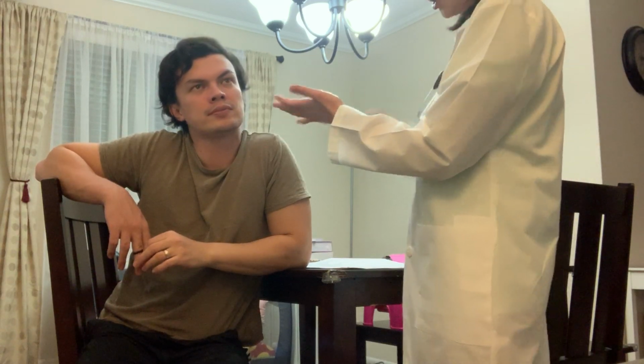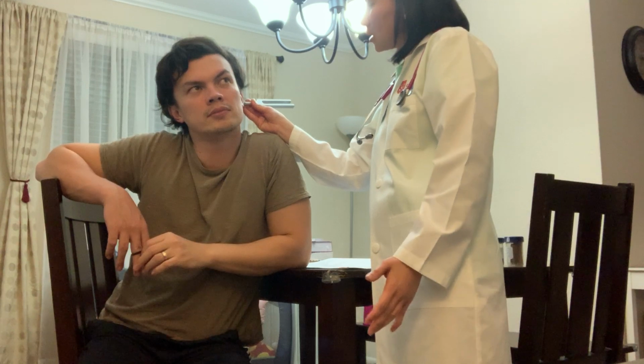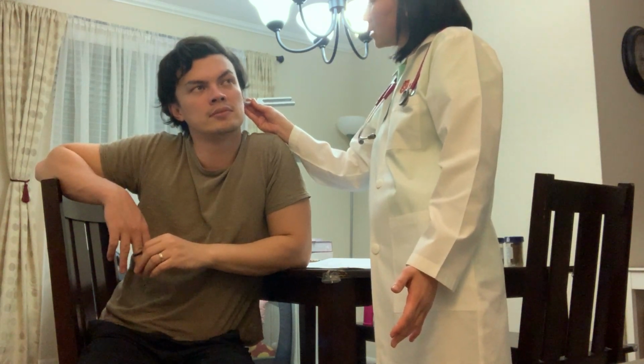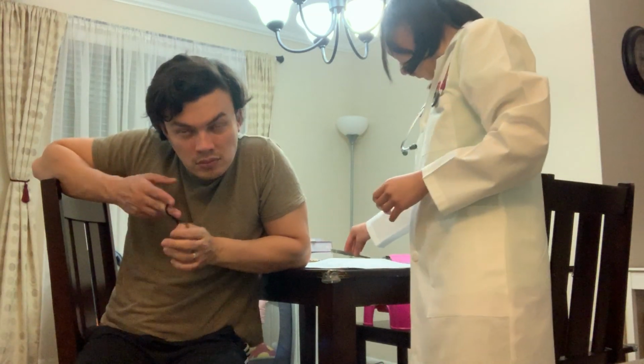Air conduction should be longer than bone conduction. So put it here on the back of the patient's ear. Can you hear it? Tell me when you don't hear it anymore. And then, can you still hear it? It should be on the same side. So as I said, air conduction should be longer than bone conduction. So that would be for the ears.